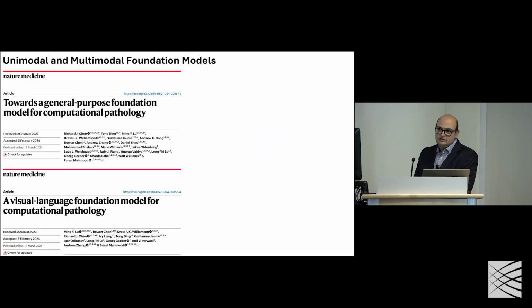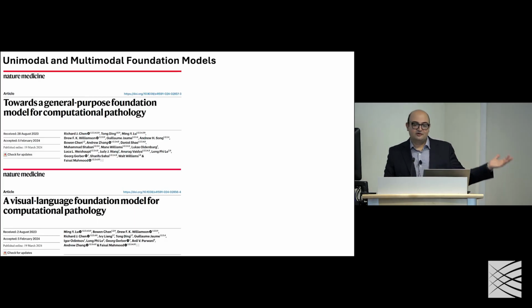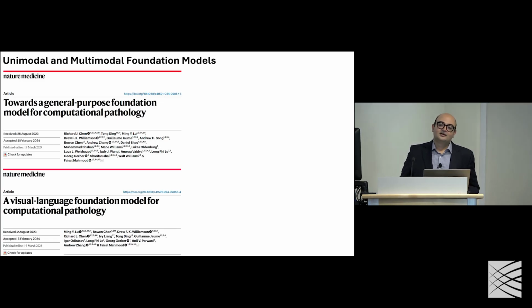And I think the critical inflection point was when Meta showed in their DINOv2 study that the diversity of data is much more important than the quantity of data, something that we always knew, but it was like a proof. That gave us an opening: we don't effectively need to scan every single slide through our history to develop a foundation model for pathology. We could potentially go back to our archive, look at what the most diverse cases are, pull those and scan them, and potentially that would be good enough to develop a foundation model representing human pathology.